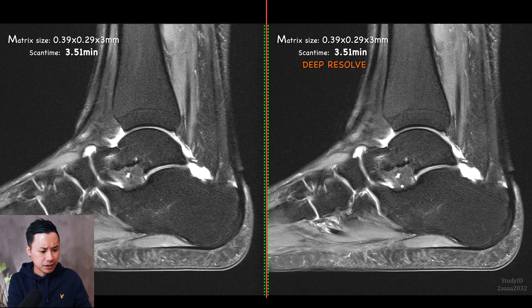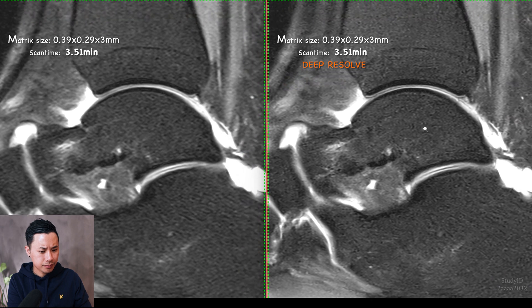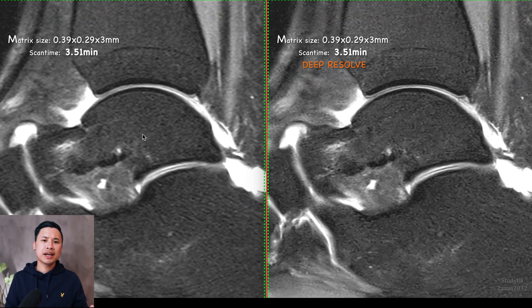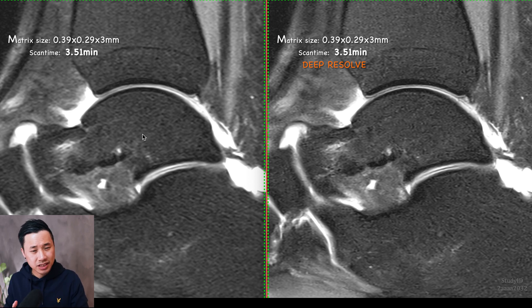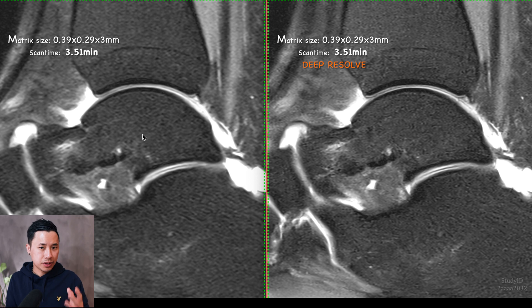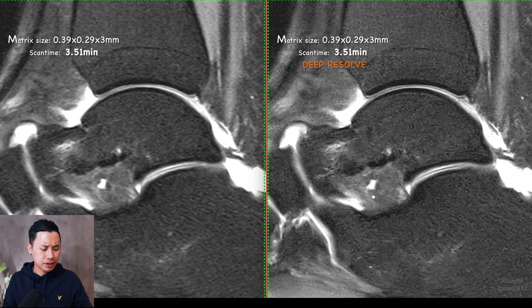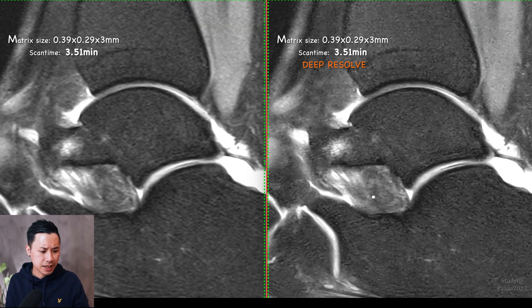Let's zoom in a little bit here because this is very interesting. You can see on the left side the image is not bad at all, but whenever you have a better image right next to it, your eyes will automatically go for the better image, right? Because it seems a little bit sharper here. Also the contour and the small structures seem a little bit better, with the same scan time.